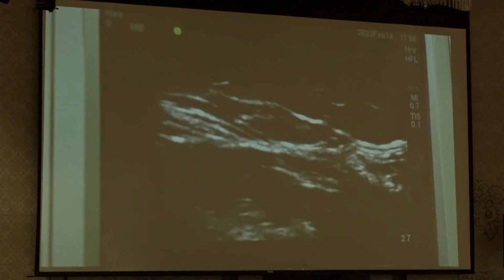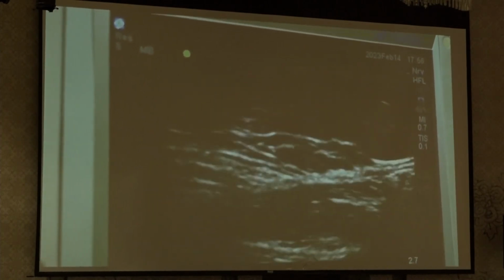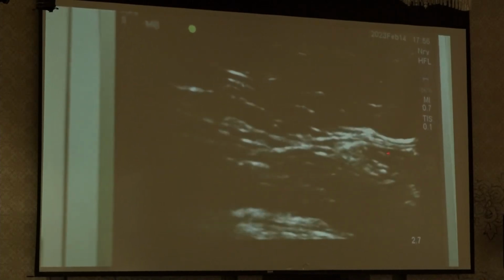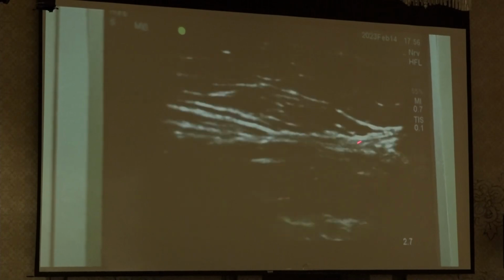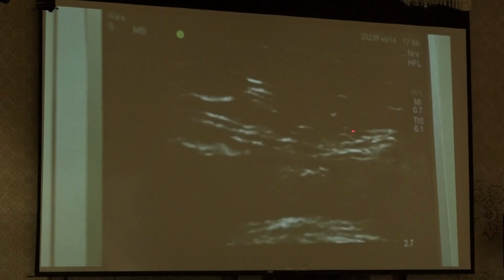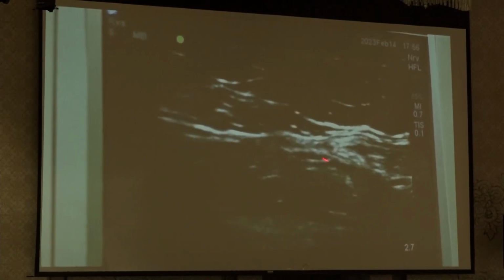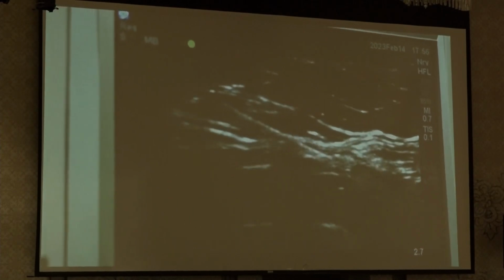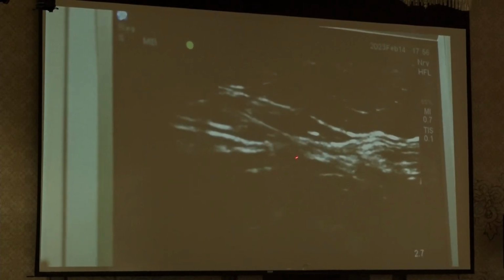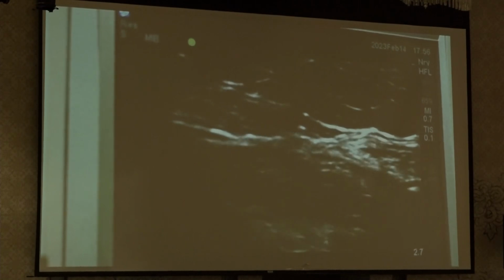This video is also almost the same, all right? You have the muscle, and then you can see there's an artery there, right? The deep circumflex iliac artery. Most of the time, the fascia iliaca is below the artery. So if you cannot see the artery, it's okay. Not all patients you can see the artery. Just go below the internal oblique muscle, right?